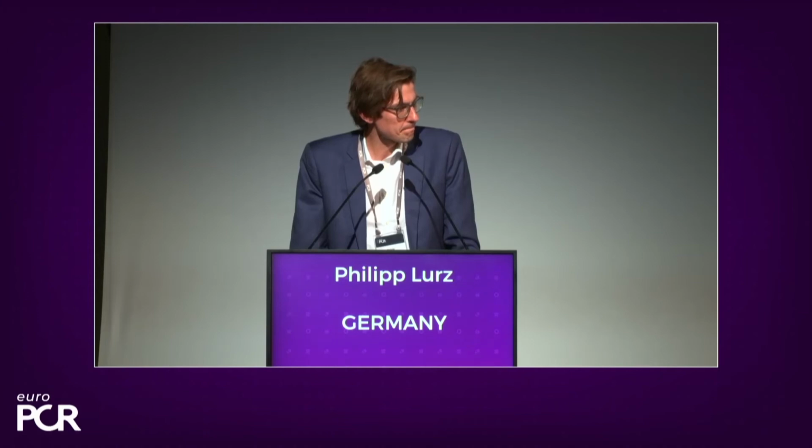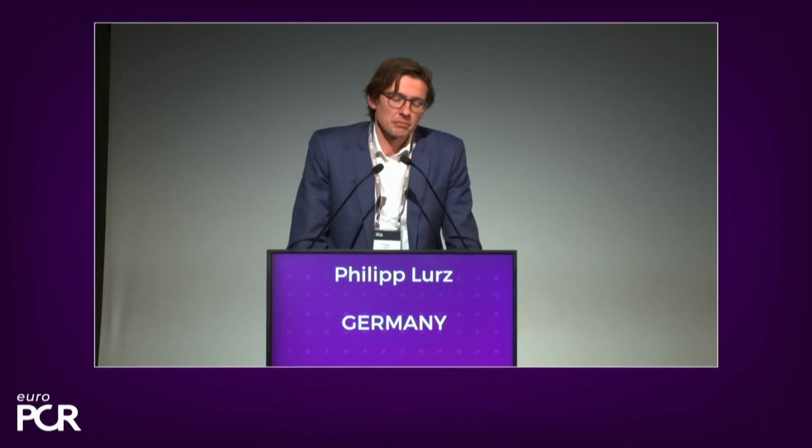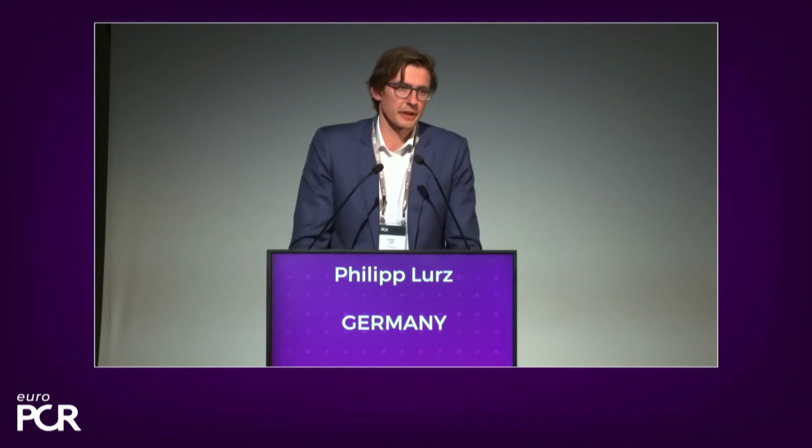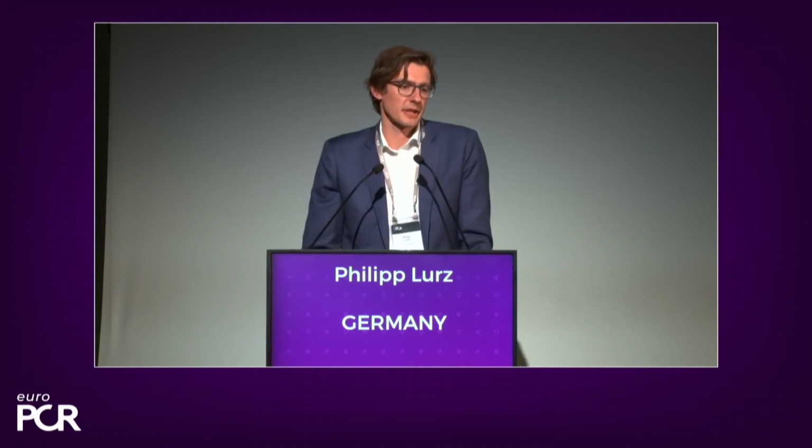Okay. And we've also seen the optimization. Do you have any tips and tricks for when we want to optimize, when we want to detach and then optimize on another leaflet? What are the checkups you need to do before? I guess my advice would be to grasp leaflets, but then really take your time and assess everything very, very thoroughly.